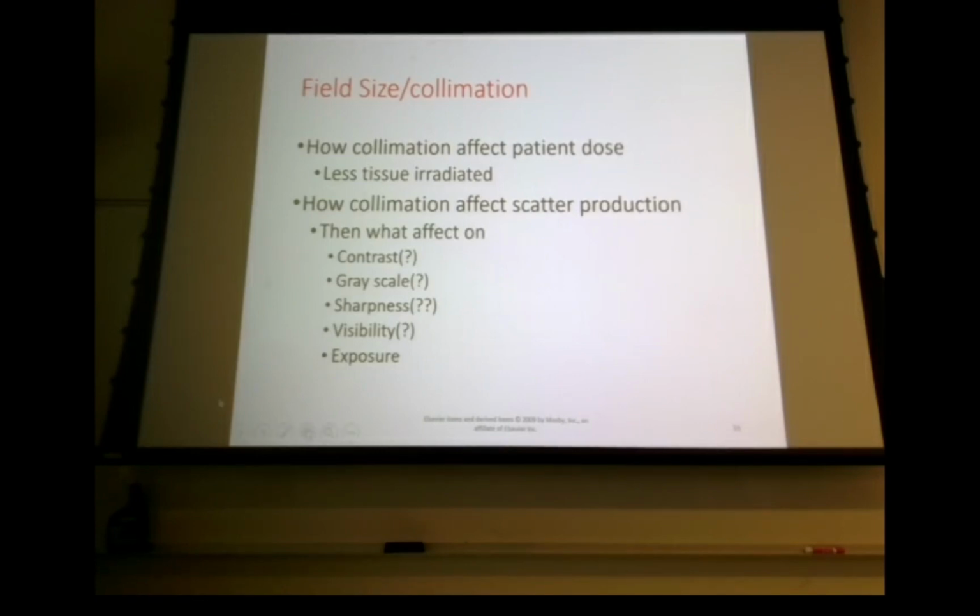So since collimation doesn't really affect this stuff quite as much as what it used to, then this becomes our primary reason for collimation, right? And I think I kind of went off on a miniature rant last week, talking about the images I see on Facebook and the x-ray groups and the lack of collimation, total lack of collimation.